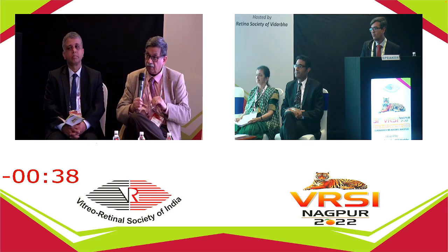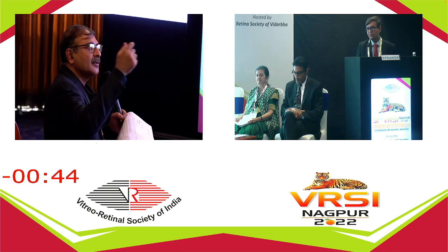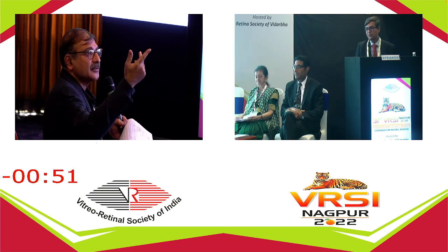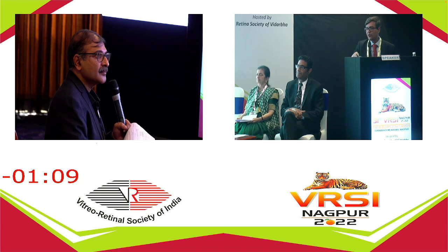Okay, so you can increase the spot size, right? Even with the yellow laser and the green laser. I think the 500, yeah, 500. On the lens, it doubles, it becomes 1000. But the laser light we use itself has the green wavelength. I think we are not able to see where the focus is or what reaction the laser is producing, as compared to TTT, where we see the reaction on the tumor itself. On the green light, you will not be able to see what is happening on the surface of the tumor.